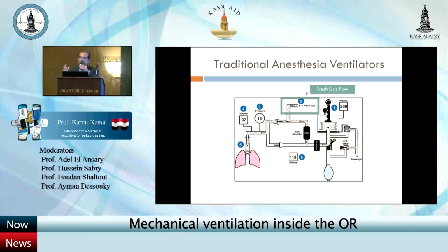The fresh gas flow inlet was placed, is this still working?